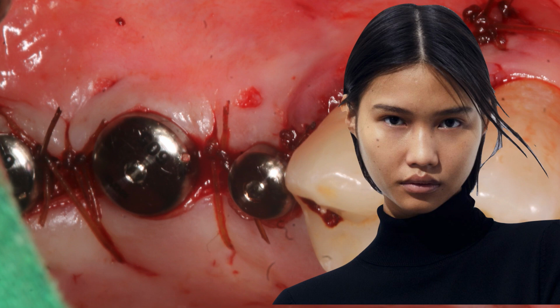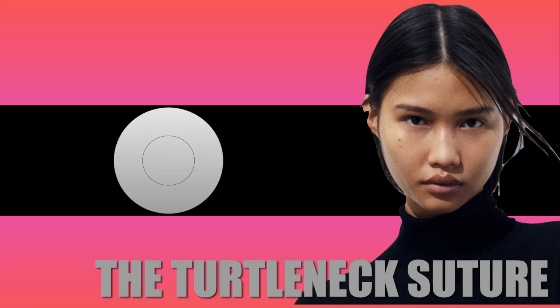So here's a nice model where the narrow neck, where the jumper, the turtleneck, simply goes over the head, and then because of the elasticity, it sort of tightly wraps around the neck. That's exactly what we want, except in the natural flap design, we don't have that sort of elasticity where it does it automatically like in a real turtleneck. So we have to create that with the suturing technique. So this is how it goes.